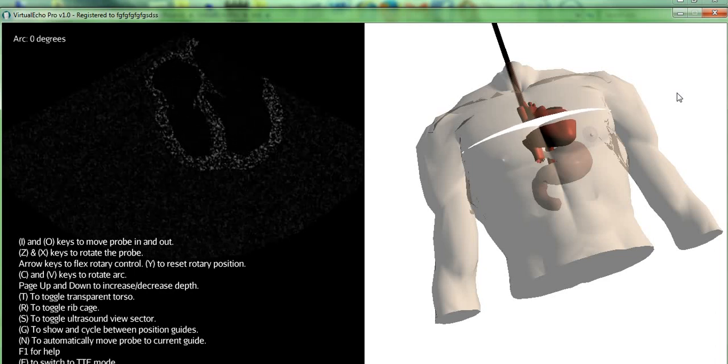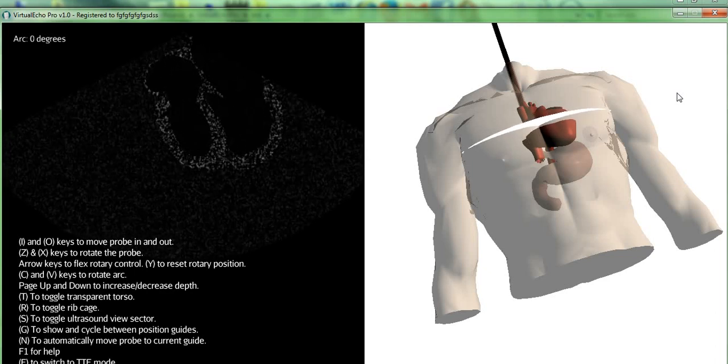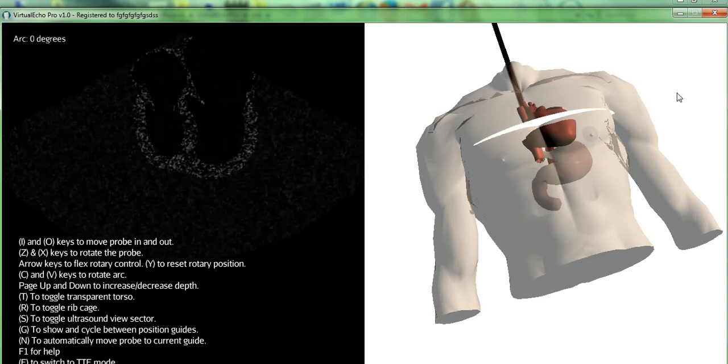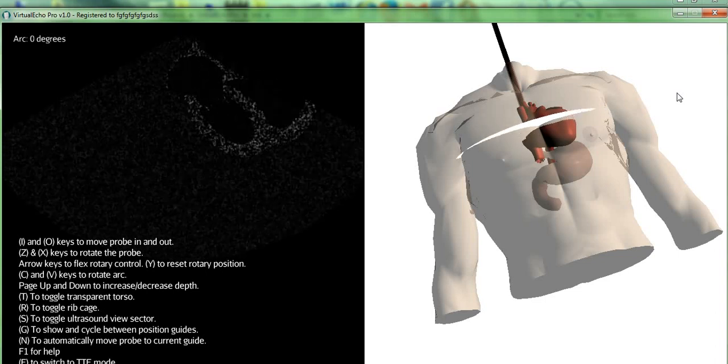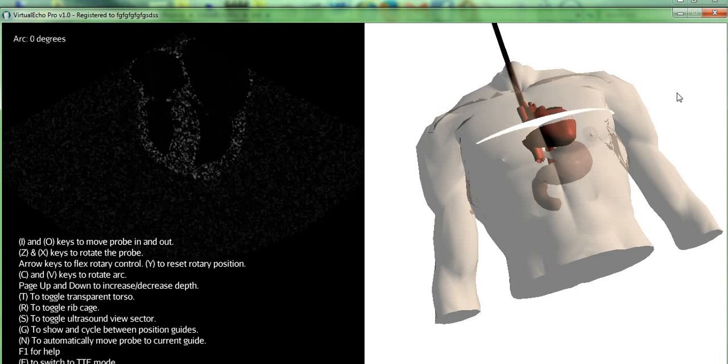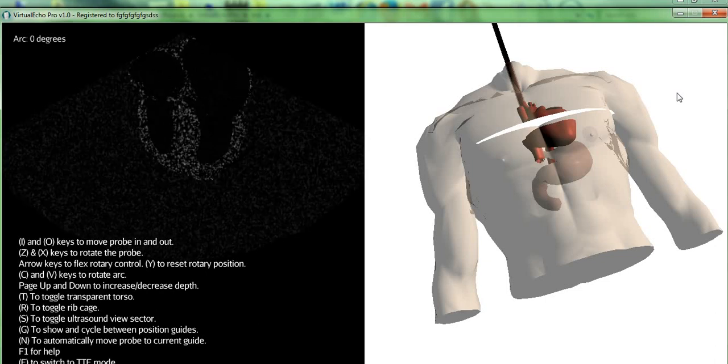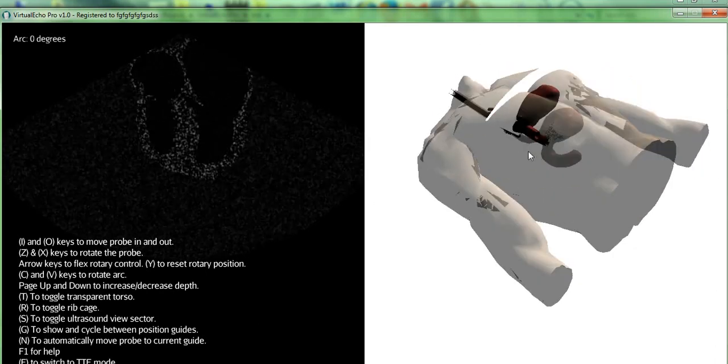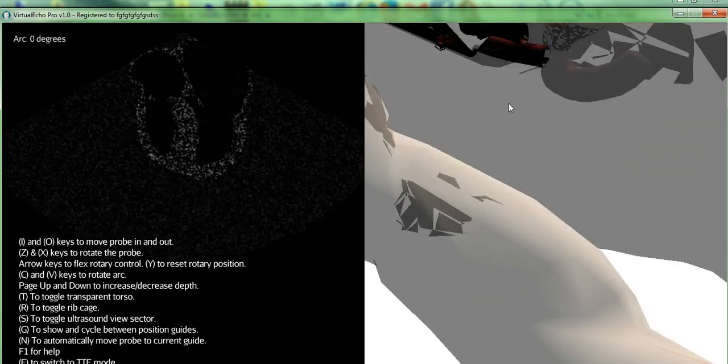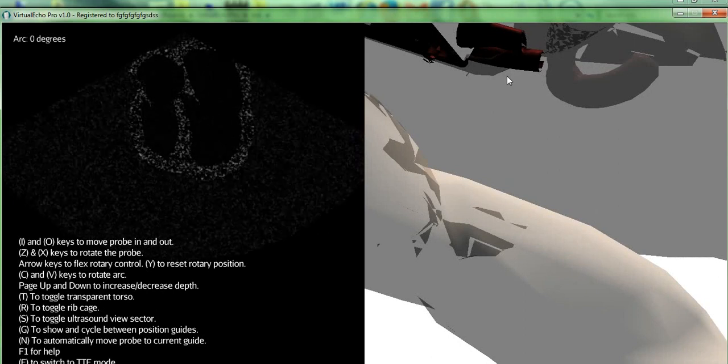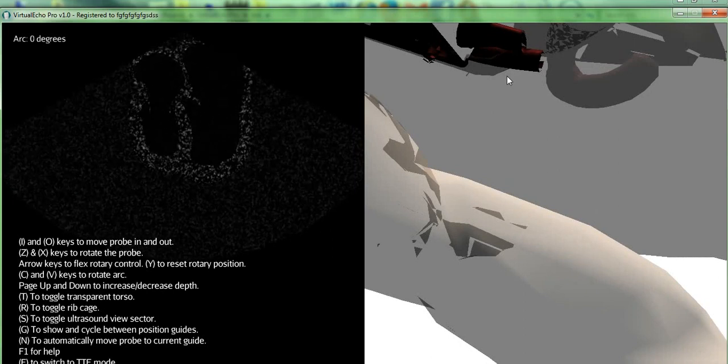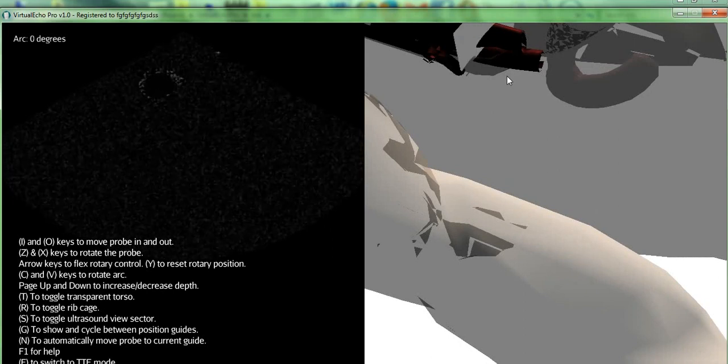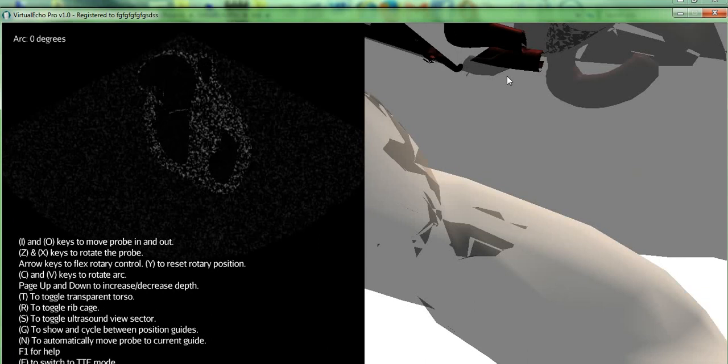You can rotate the probe using the Z and X keys. You can use the rotary controls—I'll zoom in a little bit so that you can see exactly what's happening—by the arrow keys: for up, down, left, and right.